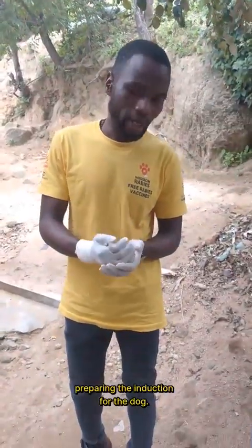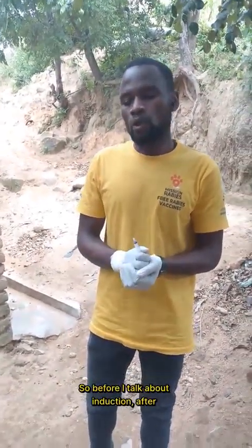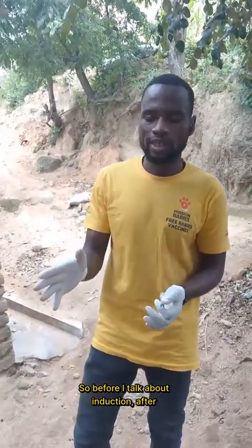Okay, so we just have to wait for a few minutes to see the effect of the sedation. The dog is going to get relaxed and calm, to avoid stress or anxiety. In the process of waiting, I can start preparing the induction for the dog. But before I talk about induction, after sedating the dog, the next step is to put an IV catheter. We use the back leg for safety reasons and use the saphenous vein.